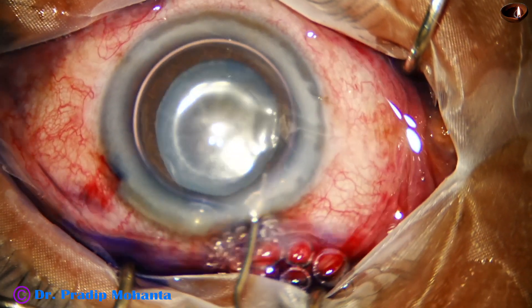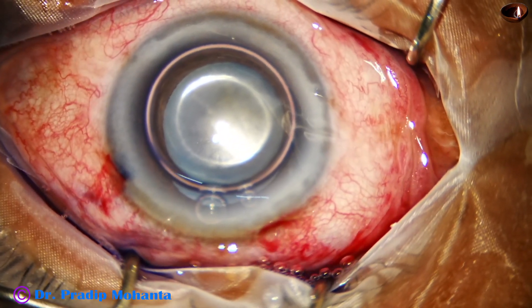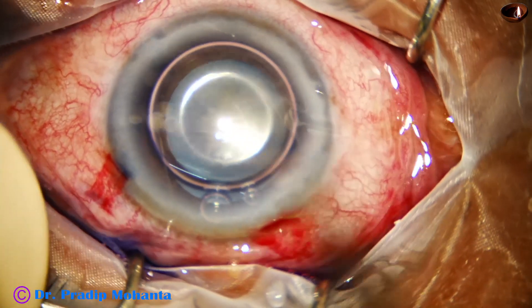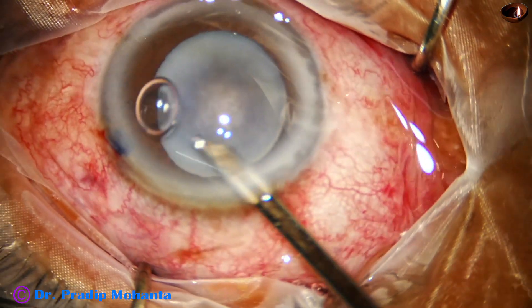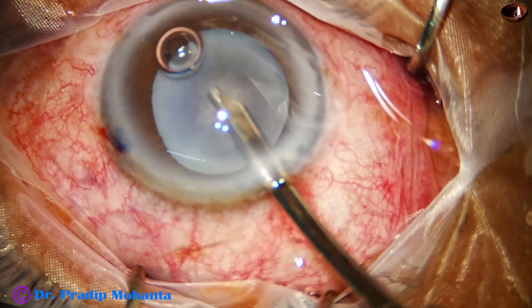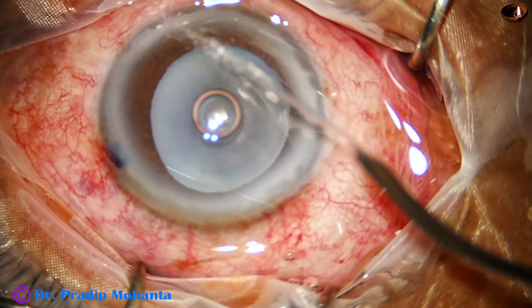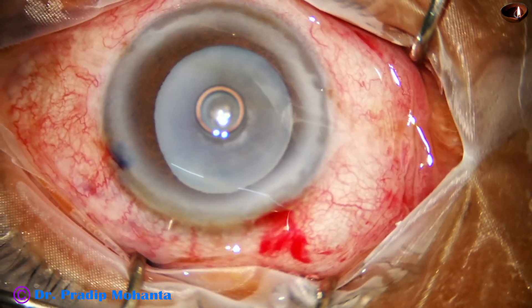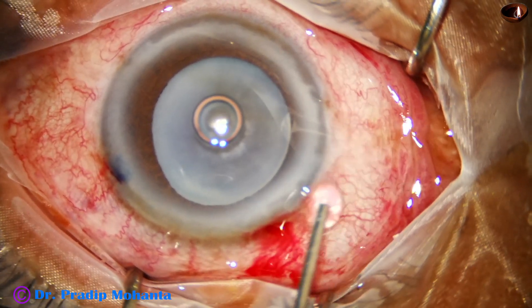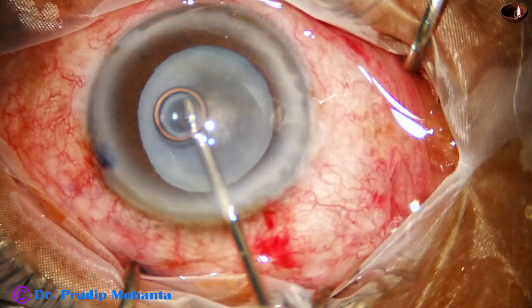A bit of adrenalin is added to maintain the dilation of the pupil during surgery. The excess dye is washed out, and the viscoelastic substance being used is 2% HPMC — hydroxypropylmethylcellulose.